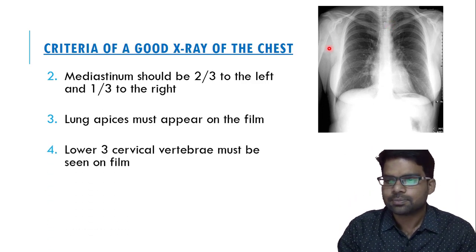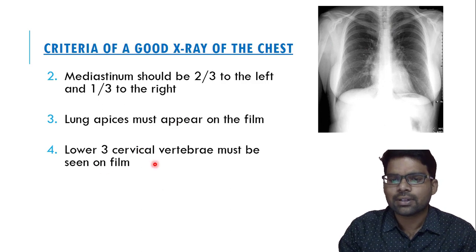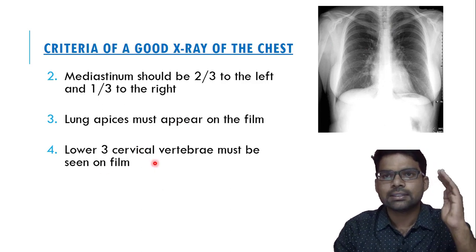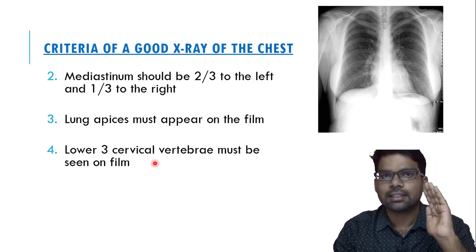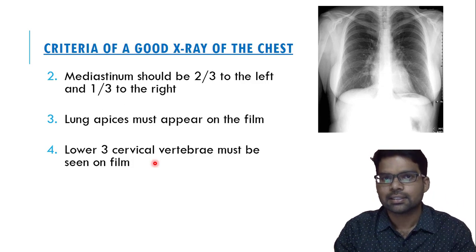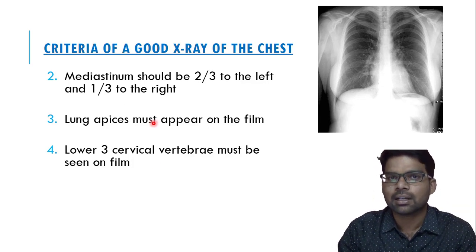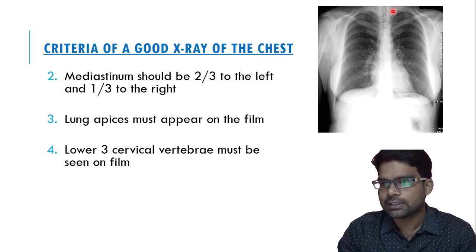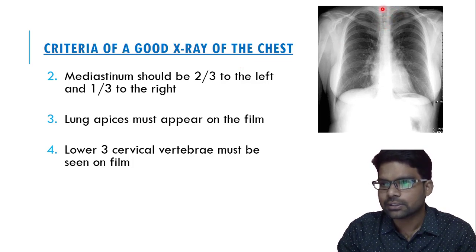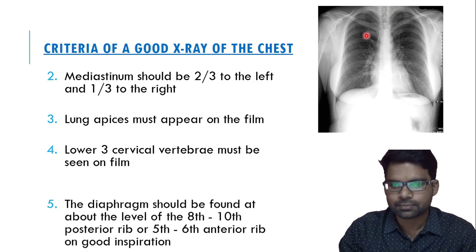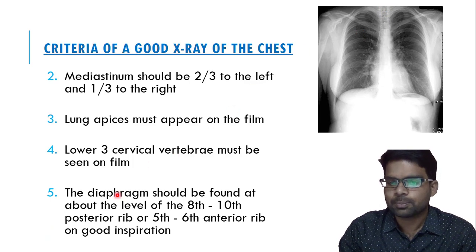The fourth point: the lower three cervical vertebrae - C5, C6, C7 - should be visible on the chest X-ray. In this film, those three lower cervical vertebrae are visible.